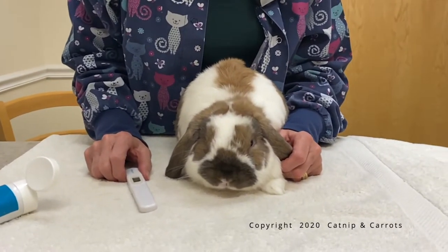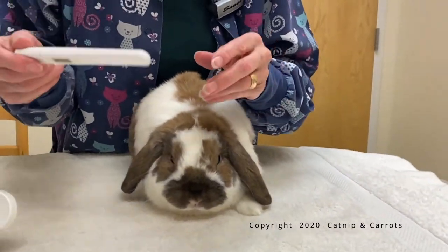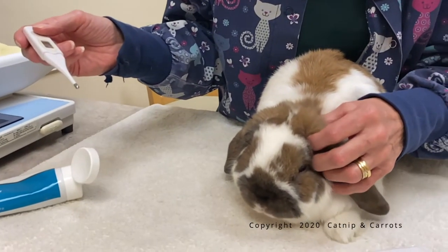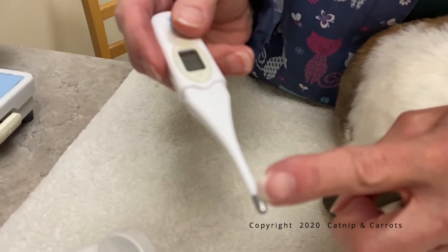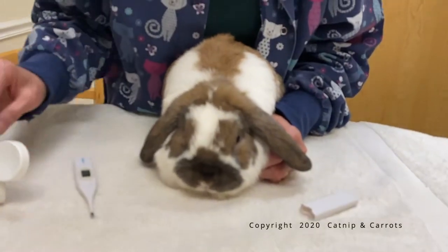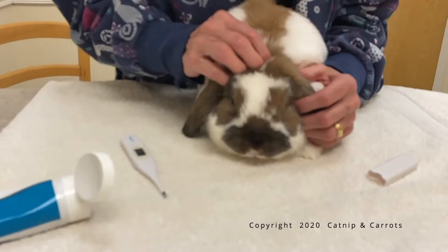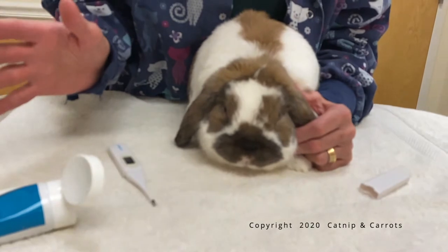Now we're going to show you how to take a temperature by yourself. The first thing you have to do is get yourself a digital thermometer that's a quick read. You don't want a thermometer that takes a minute to read. The only thing you have to put into the rectum is the little metal piece — that's what takes the temperature. The other thing you need is a lubricant. We have KY Jelly here; you can use Vaseline. If you're completely panicked and don't have anything, dishwashing liquid would do it — anything slippery.